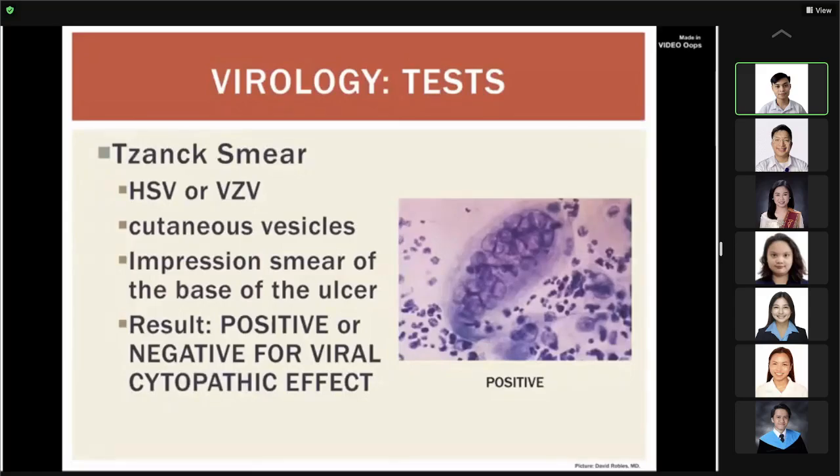So kumukuha tayo ng specimen from the base of the ulcer. So impression smear, dinidikit, or pwede rin namang kukuha ng cotton pledget, then ita-transfer dun sa glass slide.